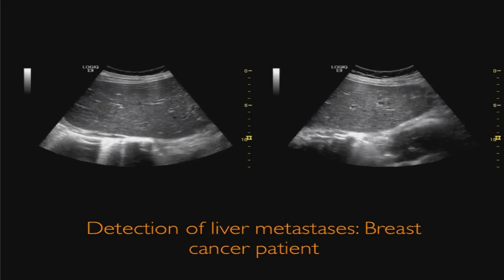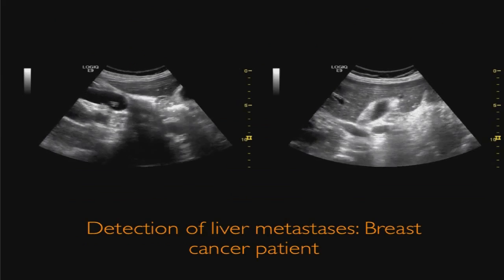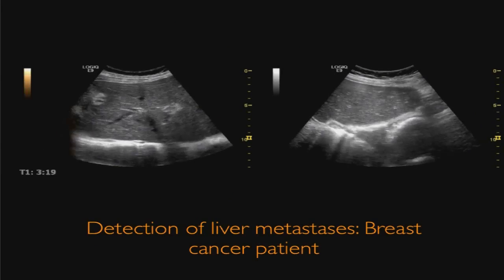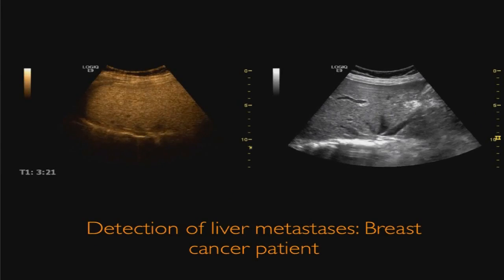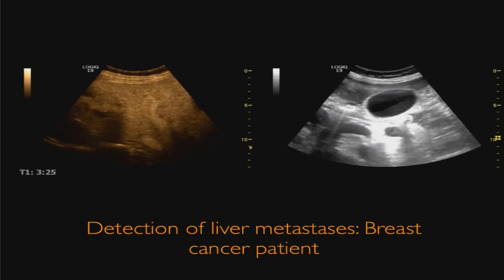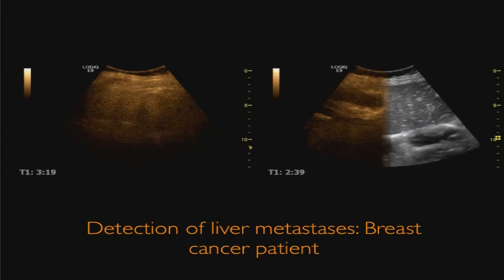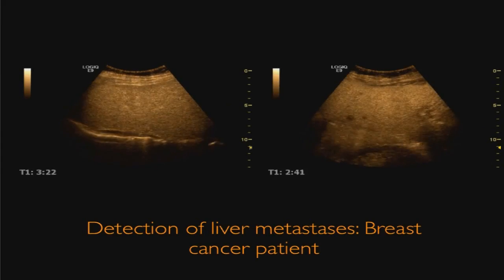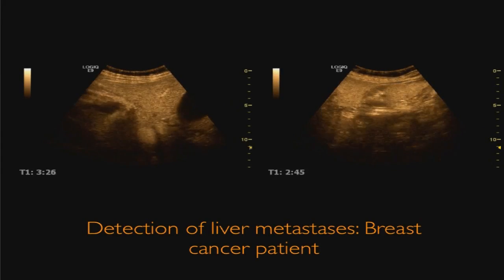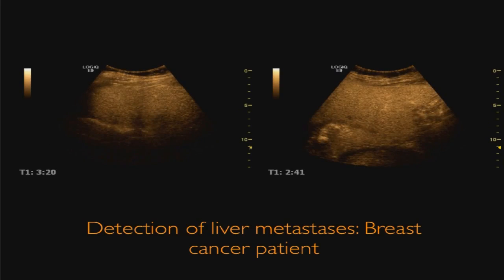Okay, let me show you. This is a patient with liver metastasis. It's a breast cancer patient. And let's see if we really see the lesions. And we see the lesions, yes, we do see the lesions. If you look very carefully, you see tiny lesions, all lesions below 1 centimeter in size. And this is the left liver lobe. You see the tiny lesions here. And we counted more than 15 lesions. And CT didn't detect one of them.